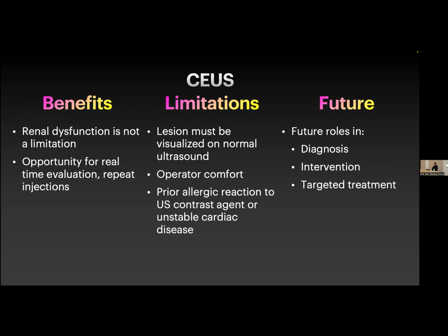And some people have additional training in this and feel more comfortable doing this, whereas at some other institutions or outpatient clinics, the radiologist might not be comfortable or have all the equipment necessary. And really the only limitation is if you've had a prior allergic reaction to this specific type of contrast agent, which is extremely, extremely rare.